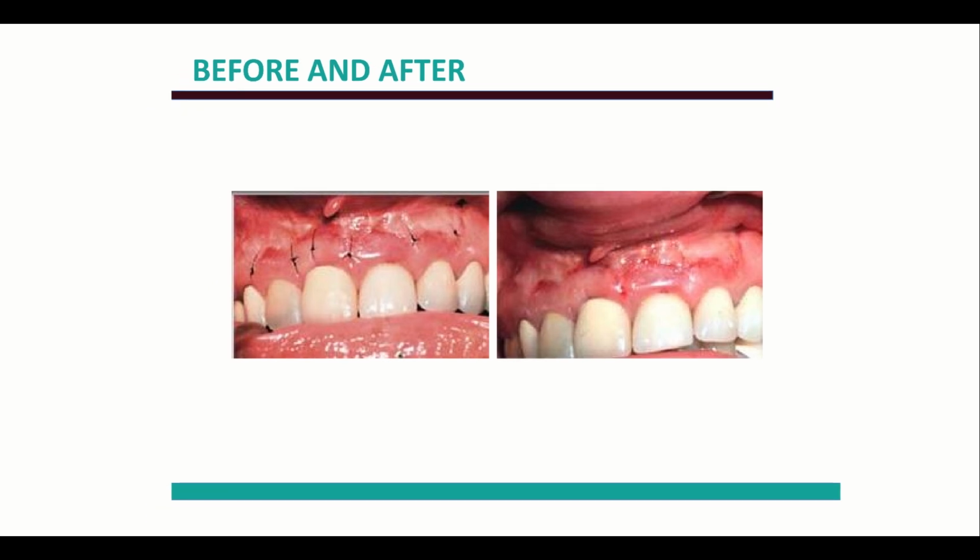So right here, you're going to grab this little knot with the hemostat or cotton pliers. Take your suture scissor, go underneath the suture here with that scoop of suture scissor, cut it, and then pull the knot out. And this is what it looks like after, with direct. And of course we have quite a bit more healing to go, but not too bad.